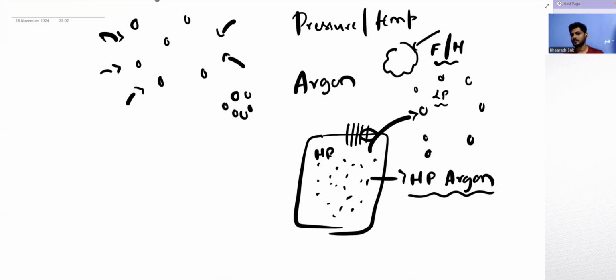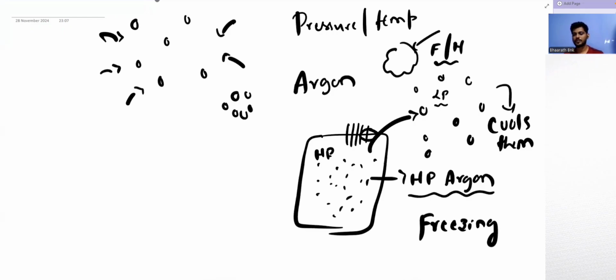Now, most gases, when they come out of high pressure and get relieved from that pressure, expand, and this expansion cools those gases. So the gases lose their temperature and cool, and whatever is in contact with them or in their surrounding environment also cools, so much so that it reaches sub-zero temperature and freezes. Right? So this is what happens. This is called the Joule-Thomson effect.